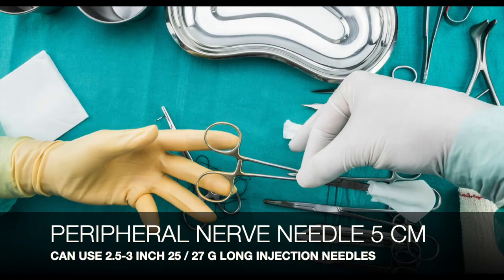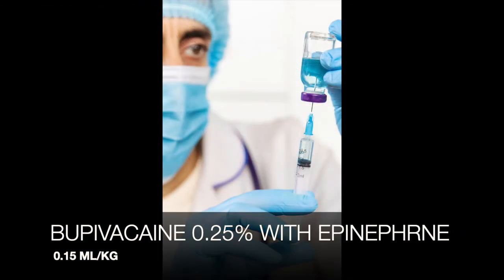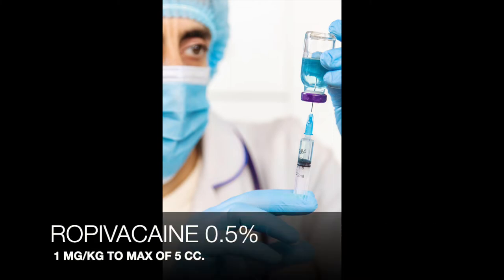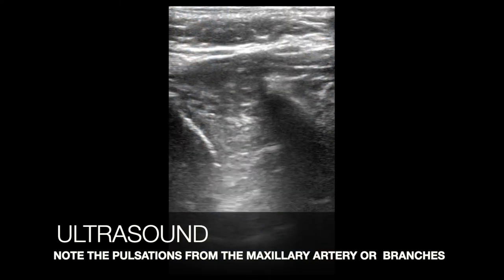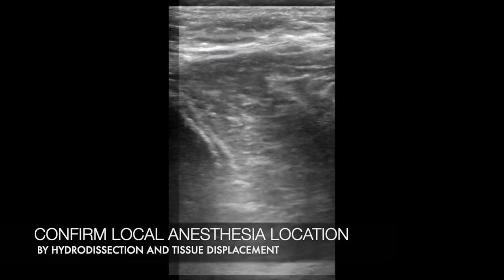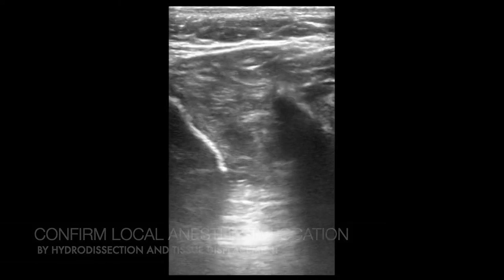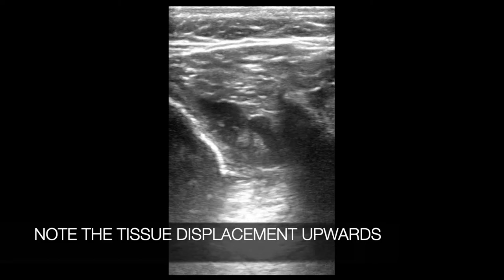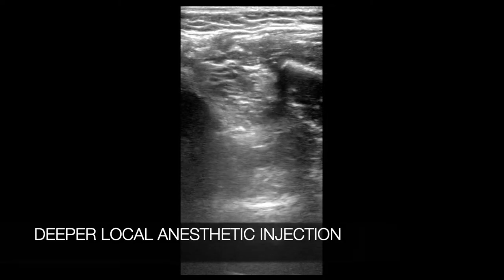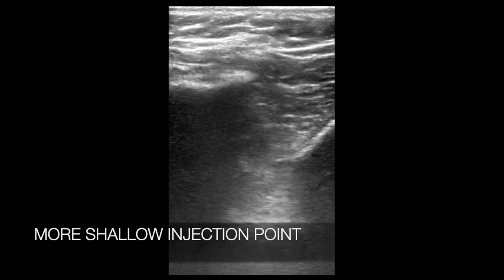Use a nerve block or injection needle with either bupivacaine or ropivacaine. On ultrasound, vascular structures can be seen in the mid-fossa area. Confirm local anesthetic location by hydrodissection and tissue displacement upwards. Injection points can be deep or shallow.